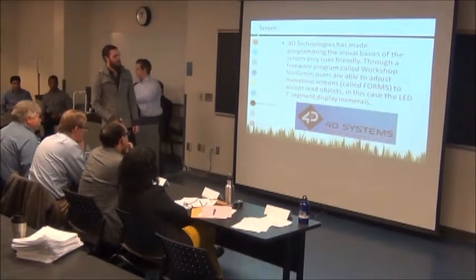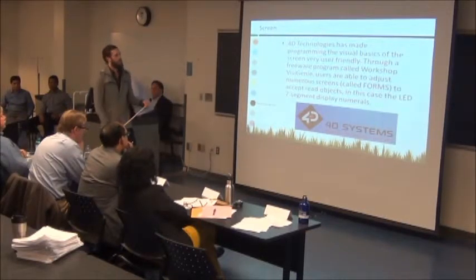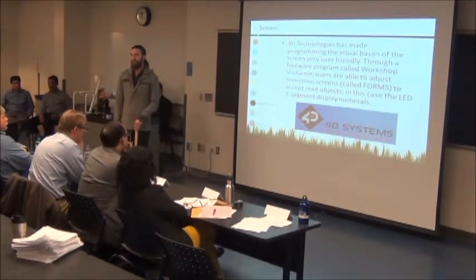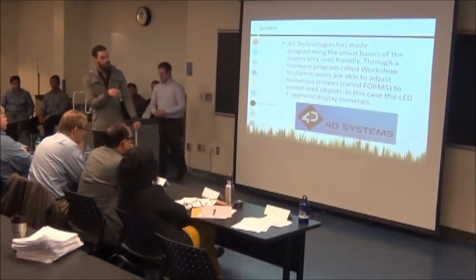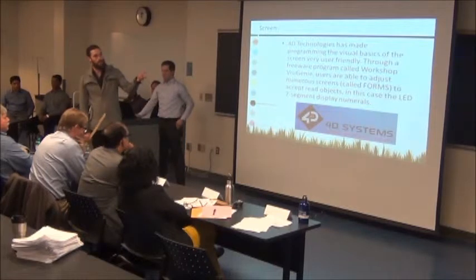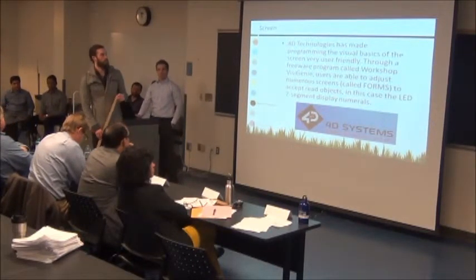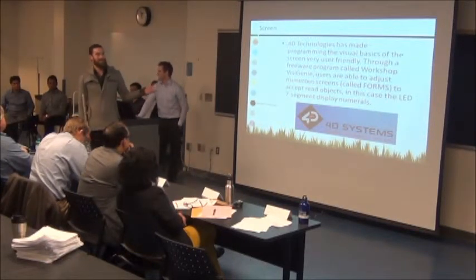They've made it very easy, 4D Systems. They have a program called Workshop Visi Genie, and this one is very user-friendly. There are a lot of people that don't know about programming, or they're not able to program, and they can use this to basically point and click a lot of the front panel design. What you see there with the logo, with the digital display, is provided mainly by this program, and basically the sky's the limit with this.